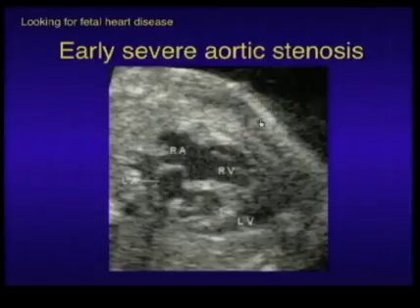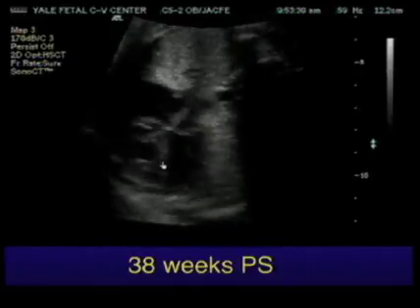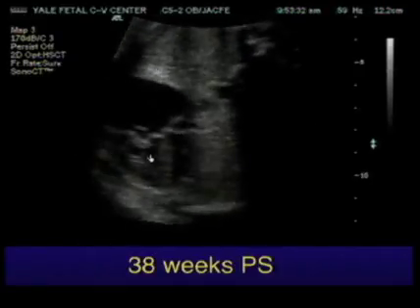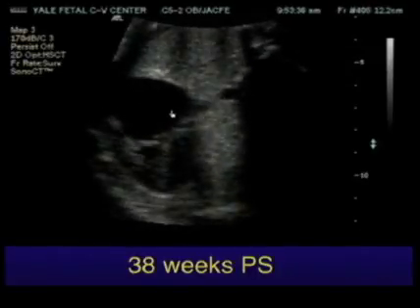Some fetuses do develop that scarred appearance to the left ventricular chamber. The still picture shows kind of a globular echogenic appearance to the left ventricle. While it's not terribly small, it's not going to grow any more during the course of the pregnancy. So these fetuses will end up with hypoplastic left heart. The right side tends to behave a little bit differently, and here's a fetus with a hypertrophic, kind of muscle-bound right ventricle. Here you see an enlarged right atrium.